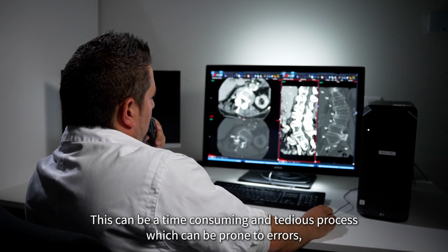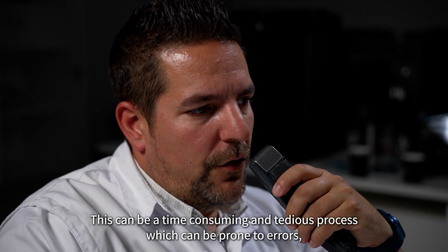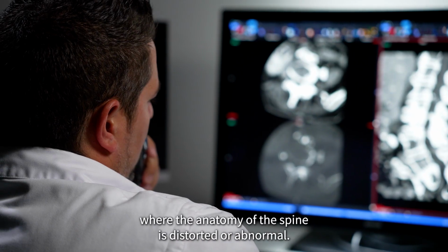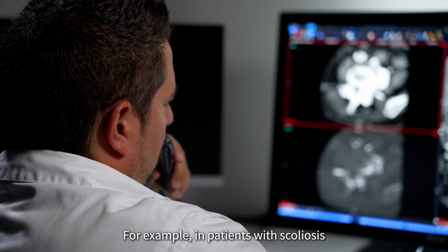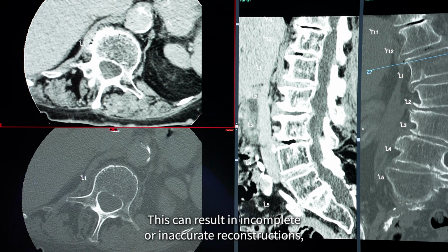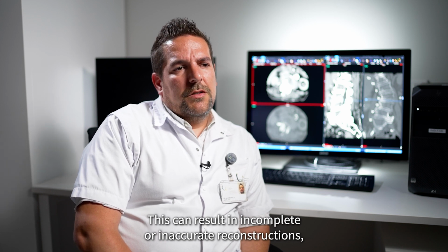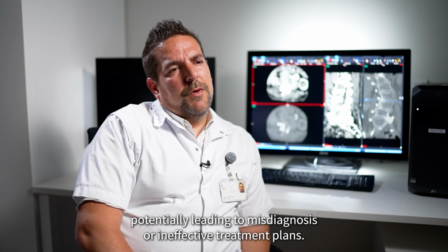This can be a time-consuming and tedious process, which can be prone to errors, especially when dealing with complex cases where the anatomy of the spine is distorted or abnormal, for example, in patients with scoliosis or other spinal deformities. This can result in incomplete or inaccurate reconstructions, potentially leading to misdiagnosis or ineffective treatment plans.